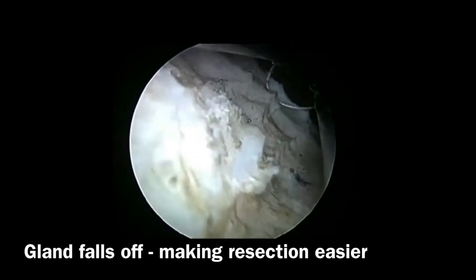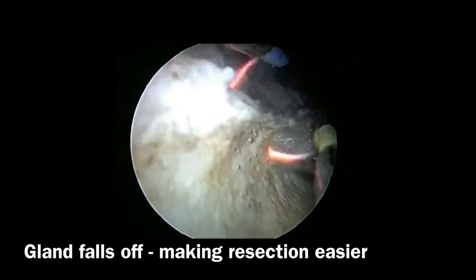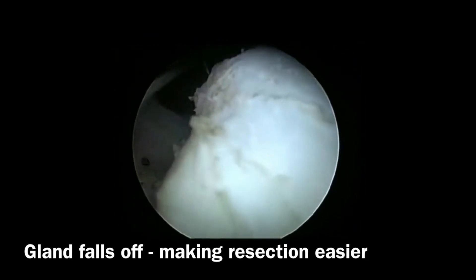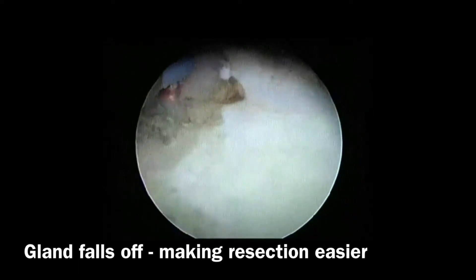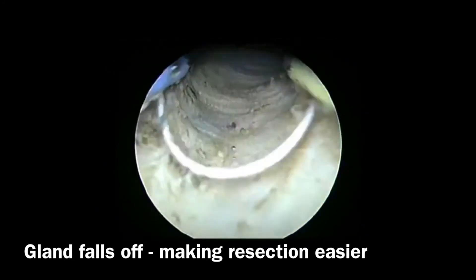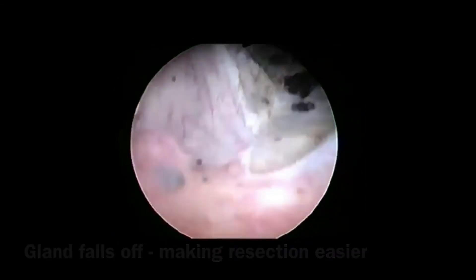As we work along the capsule, we can make out that the gland falls off from the lateral lobe, thereby making the resection much easier as there is not much bleeding. The circular fibers of the prostate mark the important landmark beyond which resection is to be avoided. The fallen gland is now resected off and there is not much bleeding.